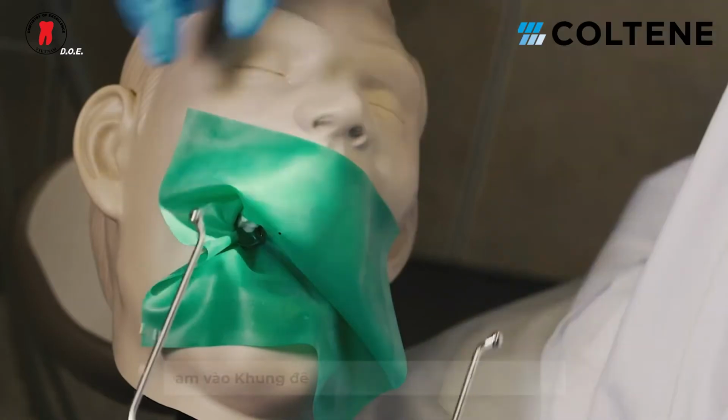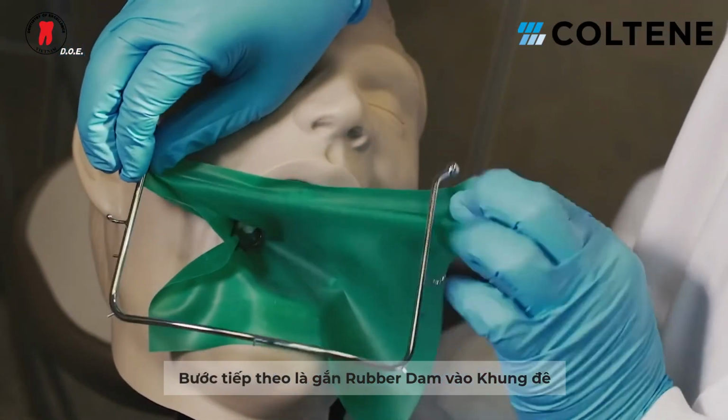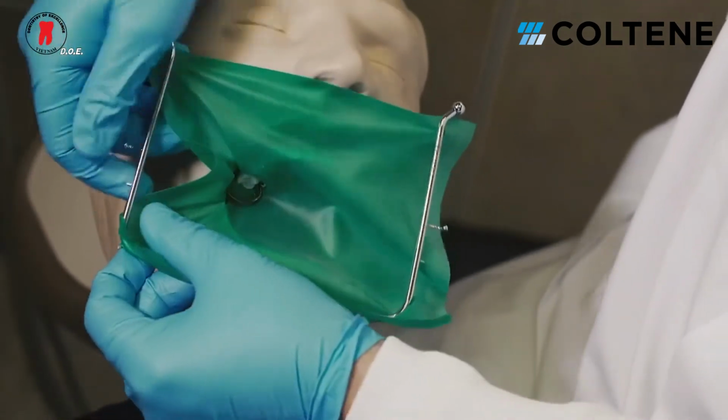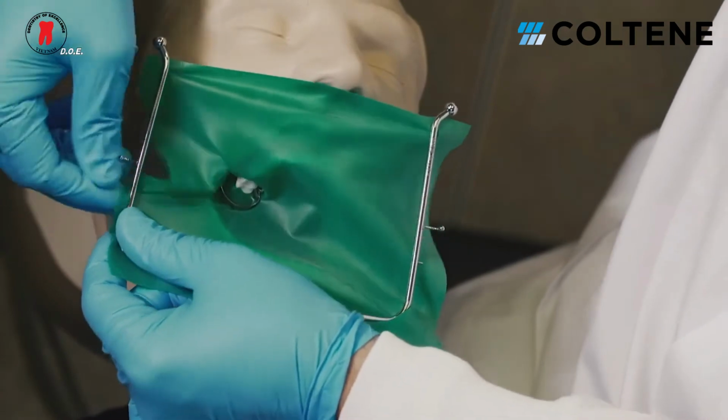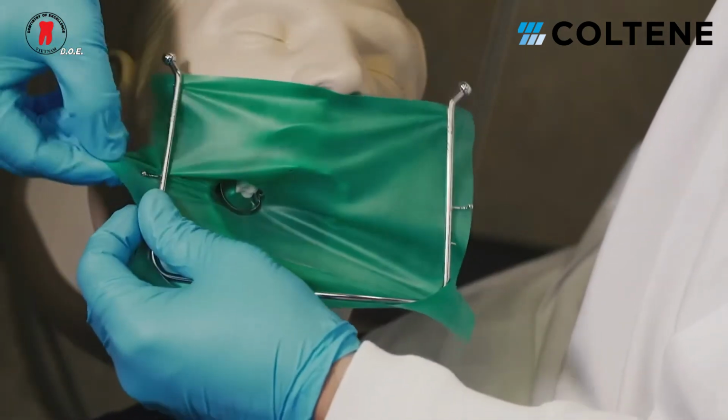So the next step would be to attach the rubber dam to the rubber dam frame. And the idea is that now you can get any excess of the rubber dam out of the working field and away from the patient's face as well.